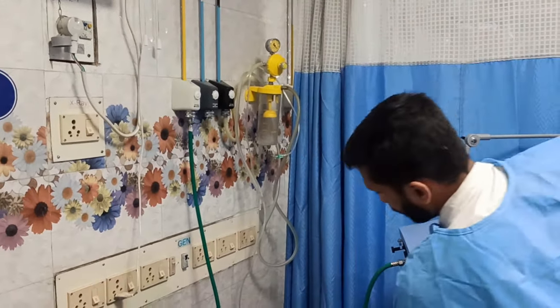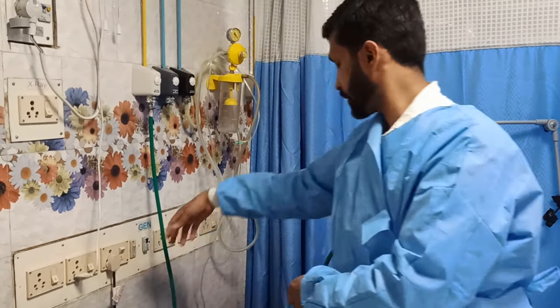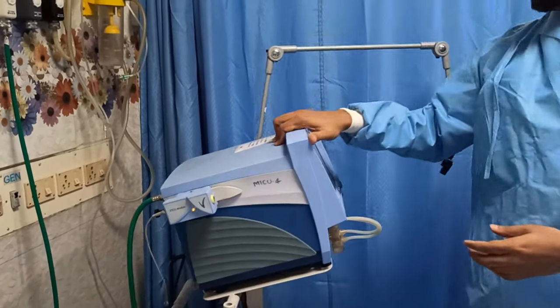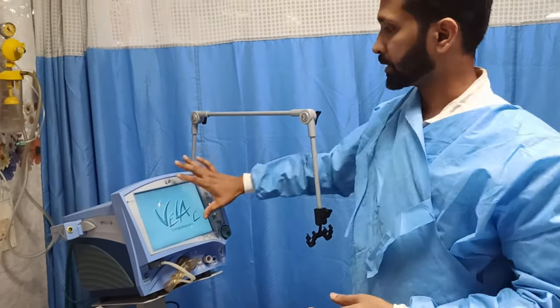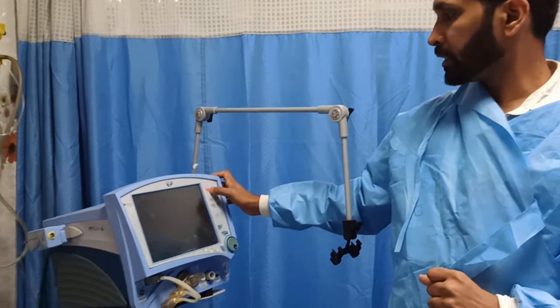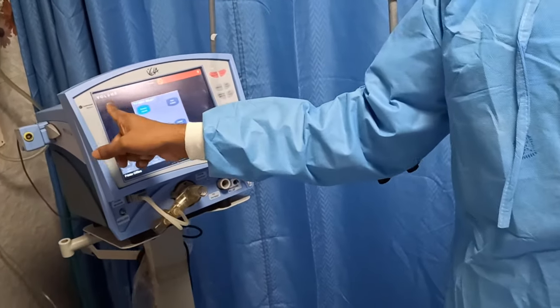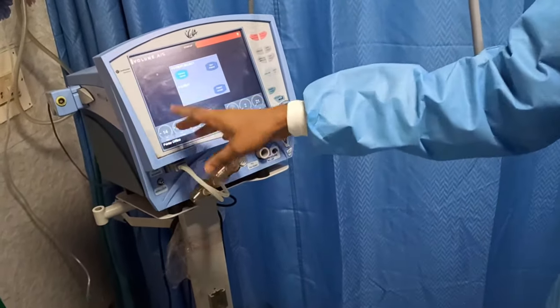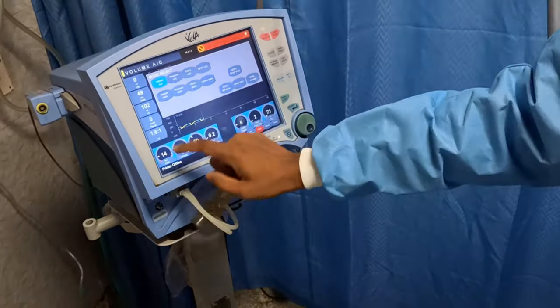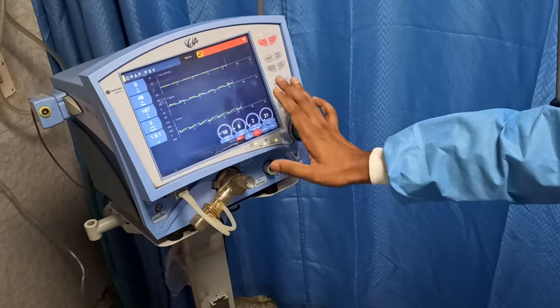And the next thing is the power. Give the power. And here you can see one on button. Make it on. Now it will alarm until the screen appears. Once the screen comes, you can see the ventilator is already in volume AC mode. How to change the mode: accept patient. Now click on this area, this volume AC mode, then click here on CPAP PSV mode, accept. Now the mode is changed into CPAP.